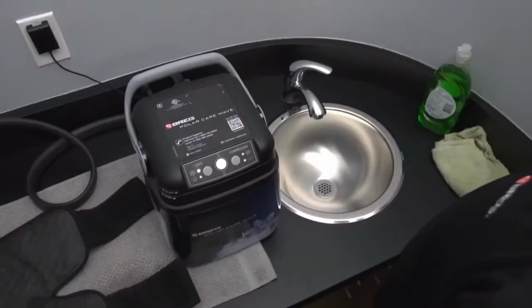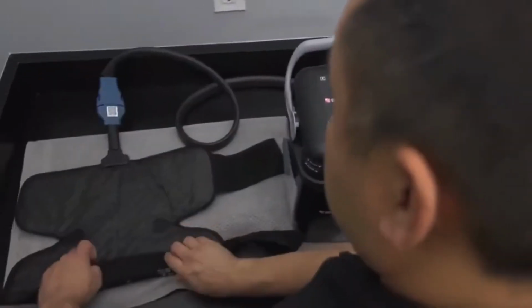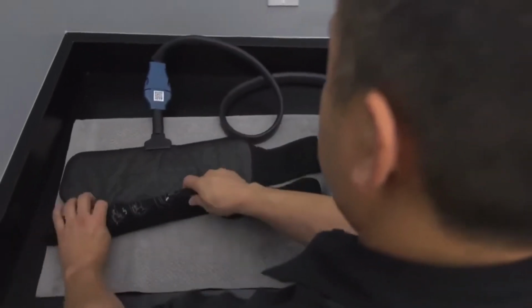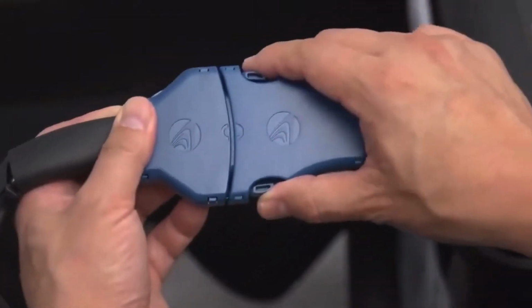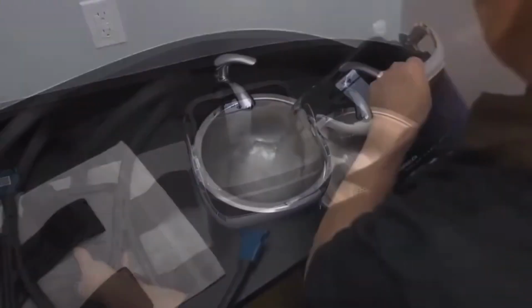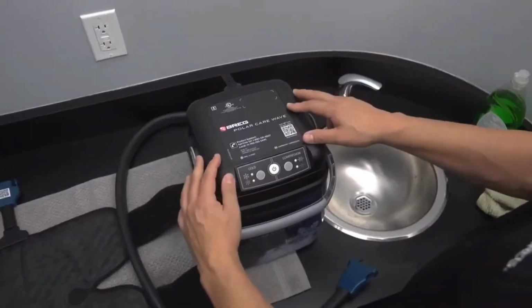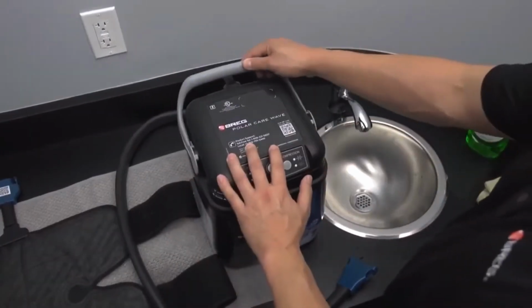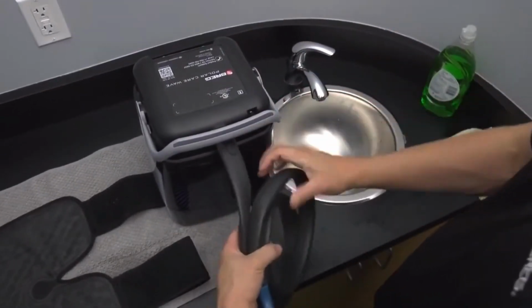To store the unit, first turn the unit off. Remove water from the pad by rolling the pad up while it is still connected and squeezing the water back into the container, then disconnect the pad from the unit. Pour out the water from the container and wipe dry. Lastly, coil the tubing using the hose management straps.